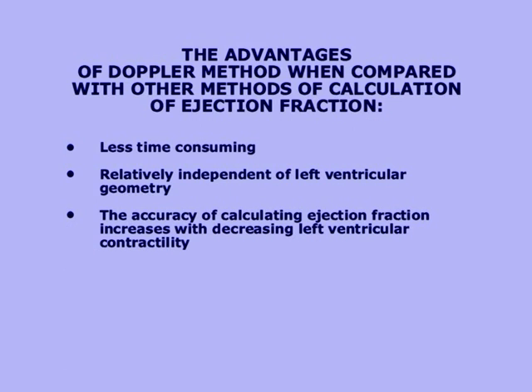The Teicholz formula might not be reliable in patients with ventricular asynergy, but conceptually, localized distortions of left ventricular geometry should be most pronounced in systole and minimal during diastole, when the ventricle assumes an ellipsoidal shape. So the calculation of left ventricular diastolic volume with the Teicholz formula gives reliable measurements in patients both with and without asynergy. The only exceptions are patients with obvious left ventricular aneurysms, where the distortion in left ventricular geometry persists during diastole.